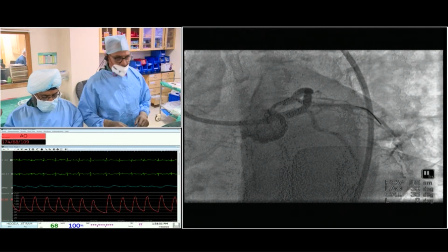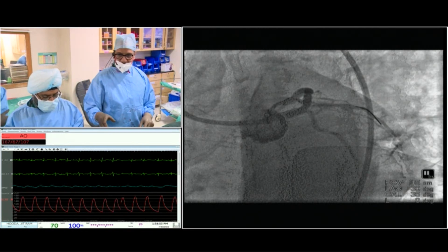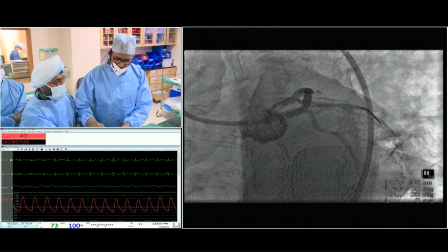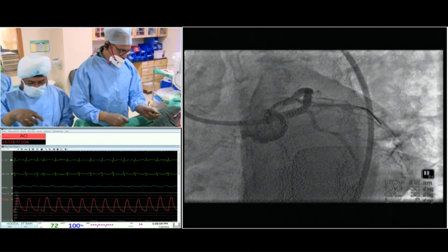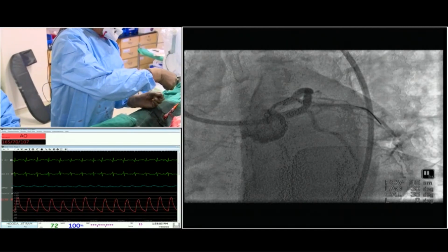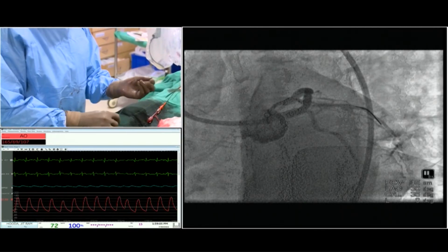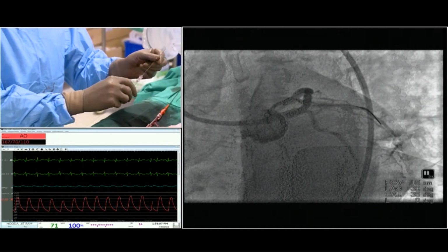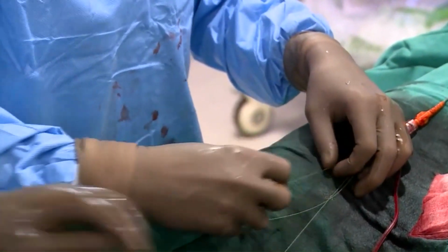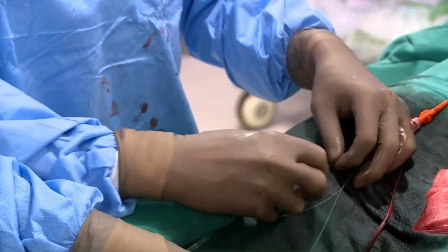Go. The definite indication is, as you agree, if there's a stenosis and also slow flow or some dissection, all that will definitely need intervention. Without any of these, it's anybody's choice. But if possible, you try to avoid working too much on the ostial LCX, because that's the commonest area of trouble in follow-up. Antonio Colombo says when you do left main bifurcation and somebody comes back with stenosis, it will invariably be the LCX ostium.